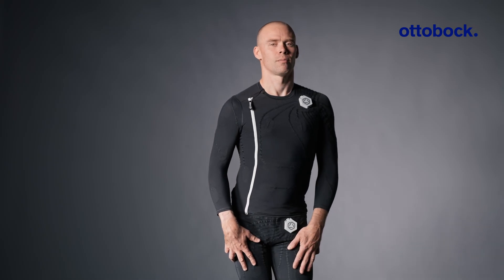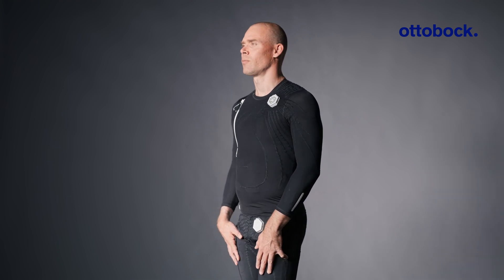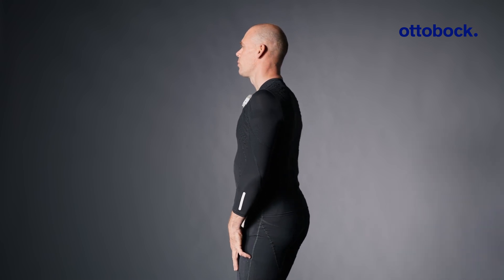This tutorial covers the essential steps for preparing and putting on the ExoPulse suit before a stimulation session. Proper preparation ensures that the suit works effectively and delivers optimal results.